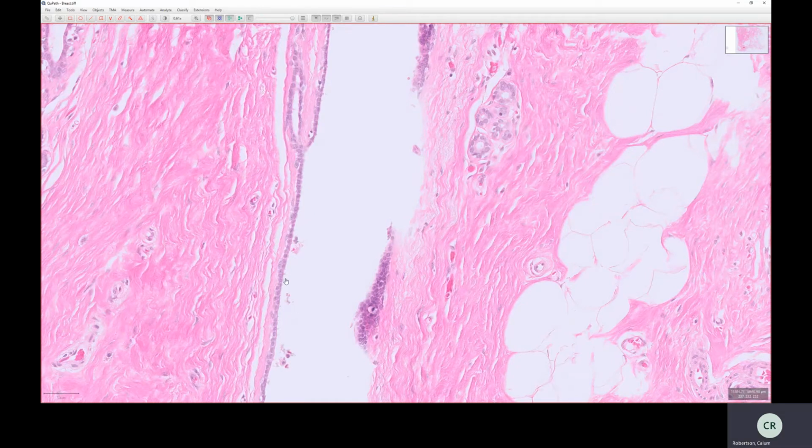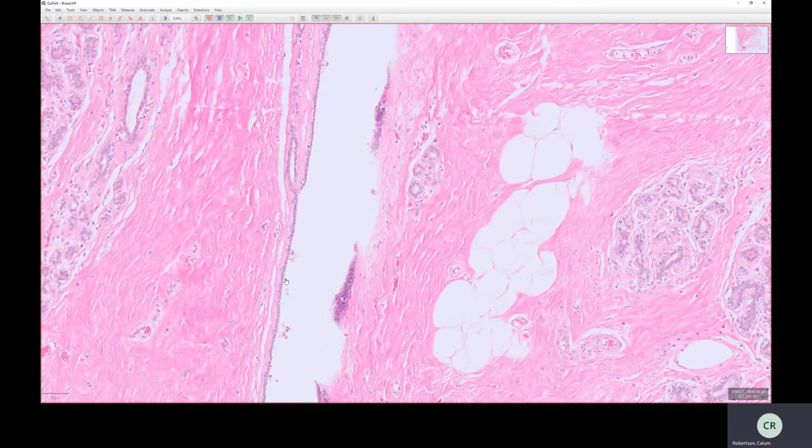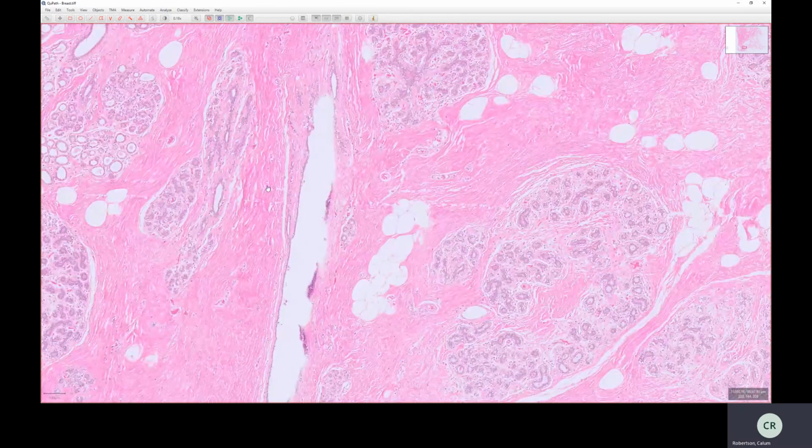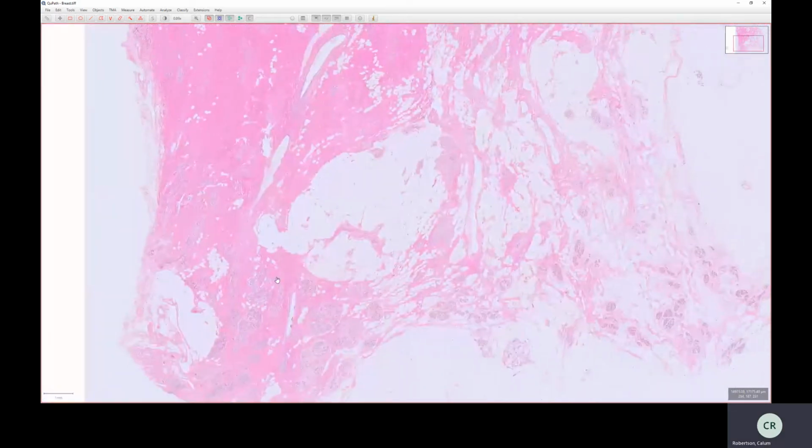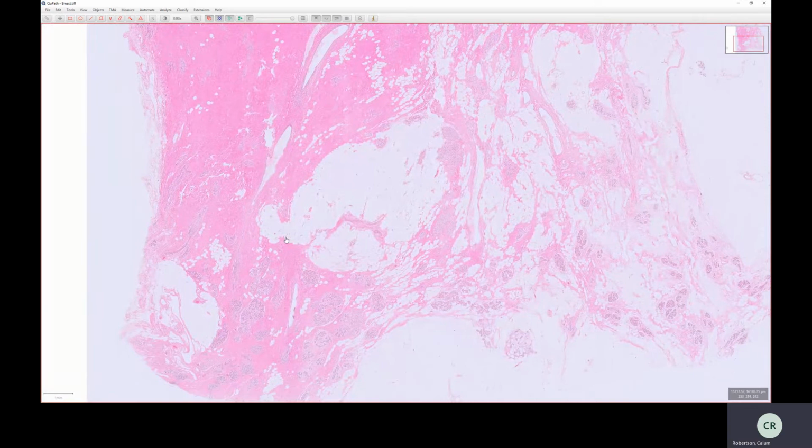Okay, so that's pretty much all there is to say about the breast, to be honest. We've got this dense collagenous stroma, the lobules with their acinar structure, architecture, the ducts, adipose. That's pretty much it. So, like the prostate, within breast pathology, there is benign pathology within breast, but the main question you're usually trying to answer is: is this malignant?